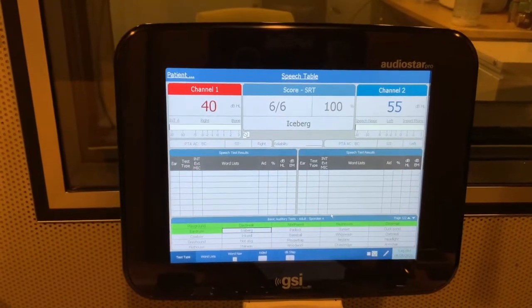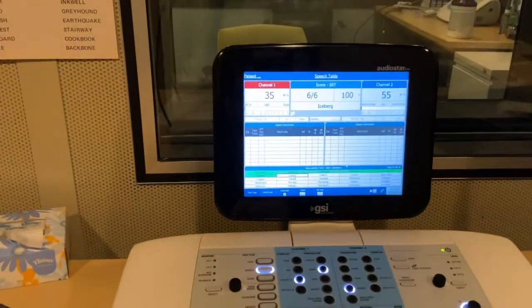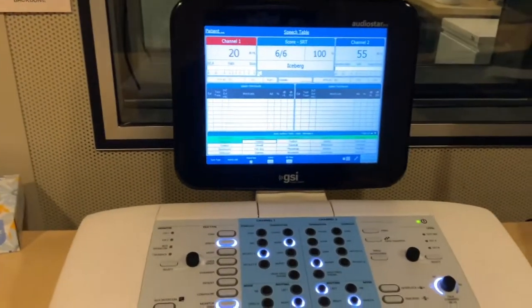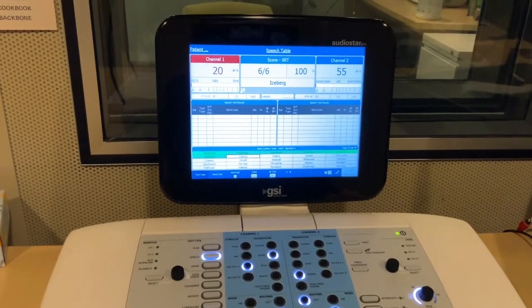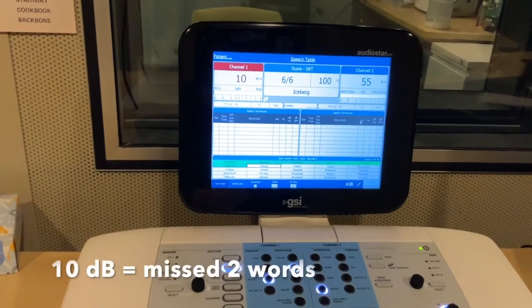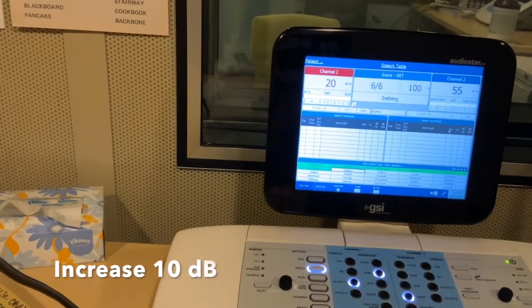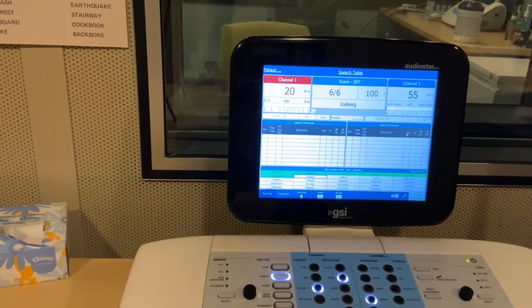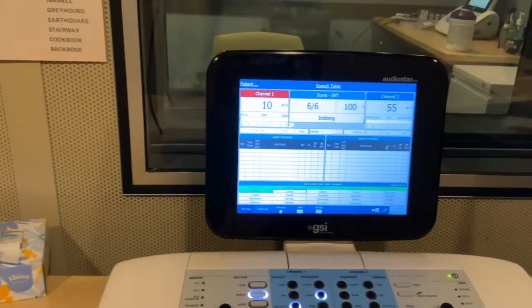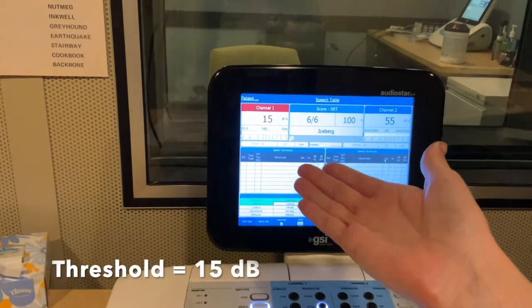So now that you've familiarized them, you can start finding your threshold. For threshold seeking, you are going to go down by 10 dB steps until they miss 2 consecutive words. And the words that you are presenting again are the 6 that you familiarized. Don't go past those. So let's say that we go down to 10 dB and they miss 2 words. Then we are going to go back up 10 dB, present some more words, and go down in 5 dB steps. We go down until they miss 4 consecutive words. And once they miss 4 words, we go up 5 dB, and that would be your threshold.